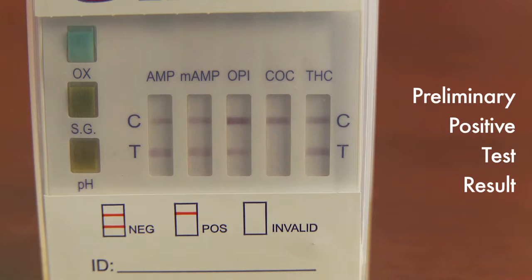After the designated 5-minute wait period, you may observe and note any preliminary positive results. A red line should appear for each substance indicated in the control region. If a second line of any color intensity does not appear in the test region, interpret this as a preliminary positive result. This means that the drug concentration in the specimen is higher than the detectable level. Remember, all positive results should be considered preliminary and should be confirmed by an alternative method.